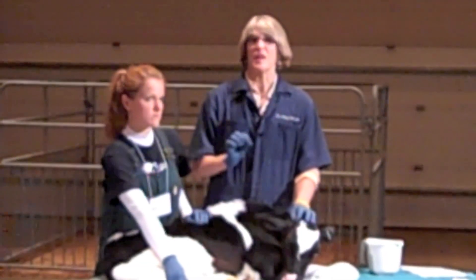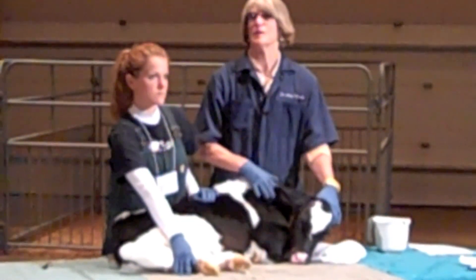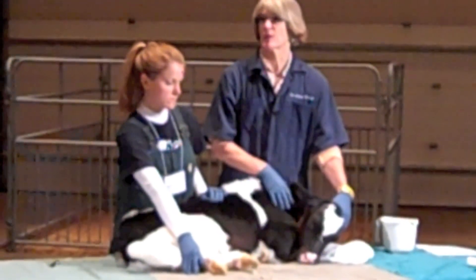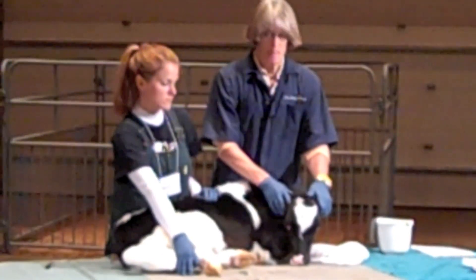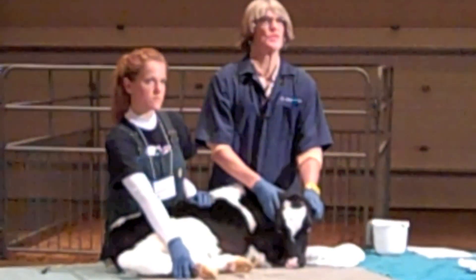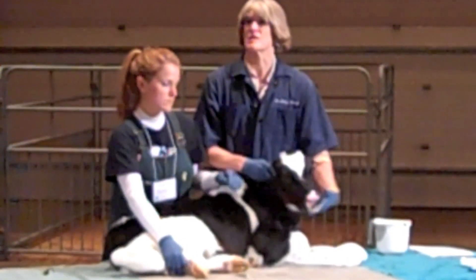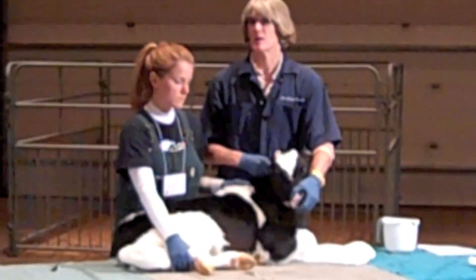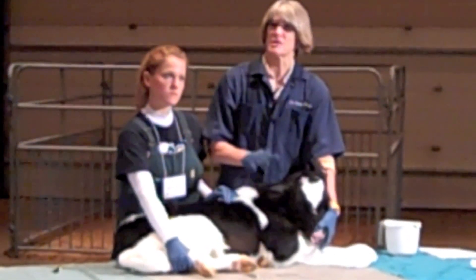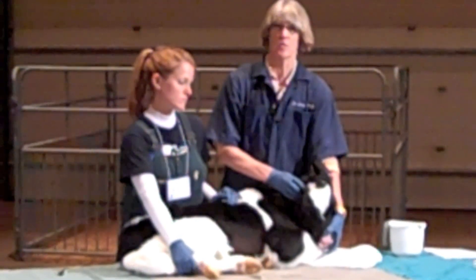Today I'm going to focus on heat dehorners — electric, butane, and propane. I'm going to use electric today for convenience, but for all methods of dehorning, and absolutely critical if you're using paste, clip the hair so you can see where the horn butt is. I brought two different sizes of dehorners, and now I can use a smaller size because I can see the horn butt.